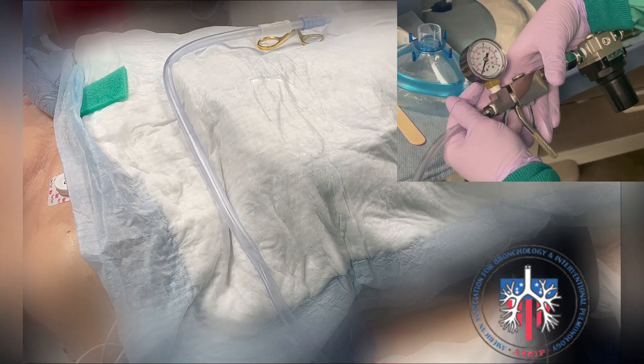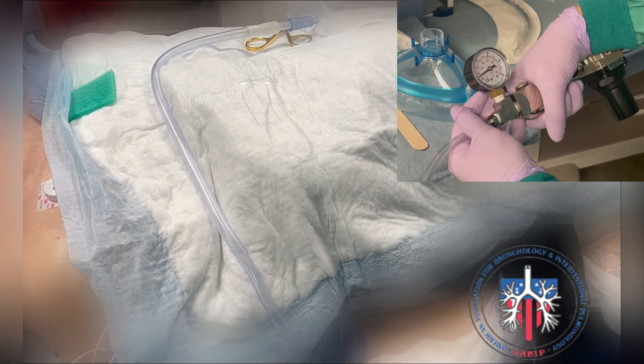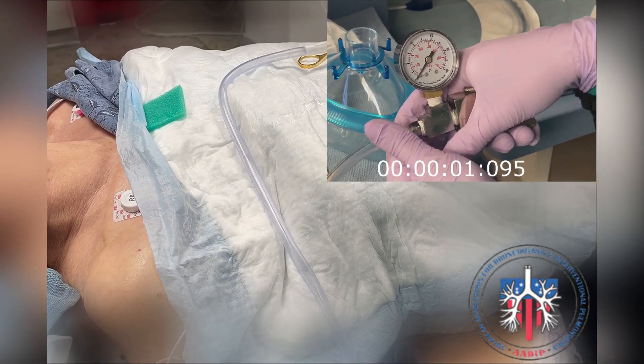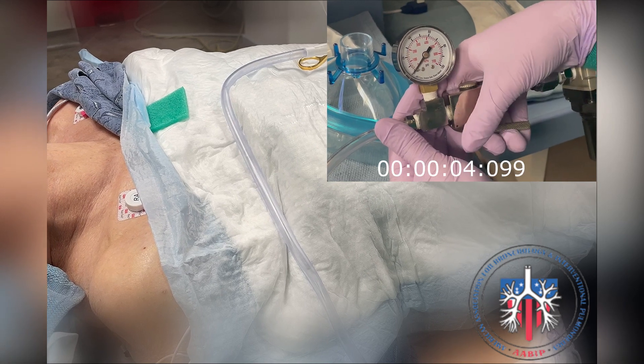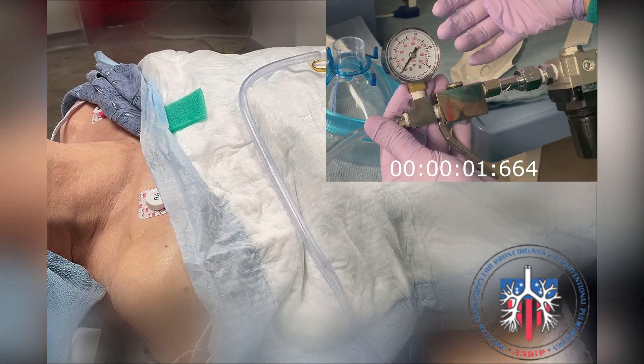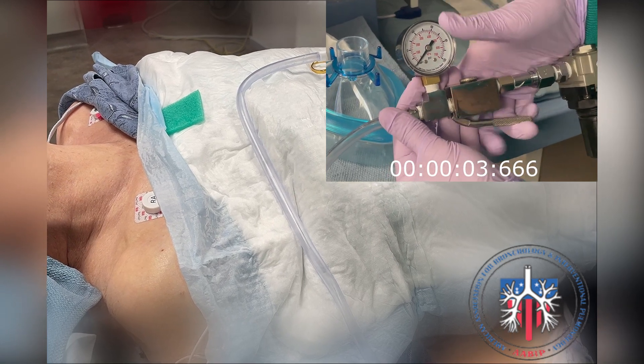When delivering a breath, watch for chest rise. Pause four to five seconds between breaths to prevent breath stacking, which could lead to a pneumothorax. Ensure that the pressure does not exceed 20 psi.